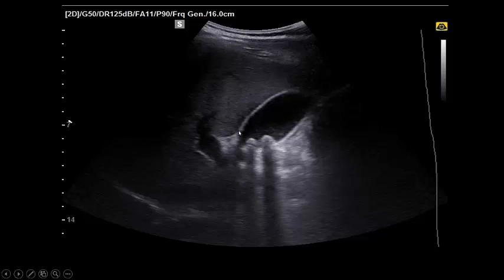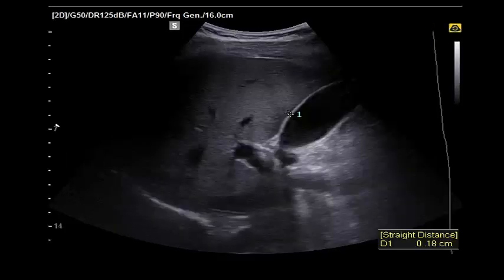First, is there any gallbladder inflammation? Is there any element or evidence of acute cholecystitis? This is number one. Number two, is there any dilatation of the common bile duct? It's a very important complication you need to search for with the biliary colic. As regards acute cholecystitis, you will measure the gallbladder wall. The diameter is expected to be less than 3 millimeters. In our patient, it's 1.8 millimeters.